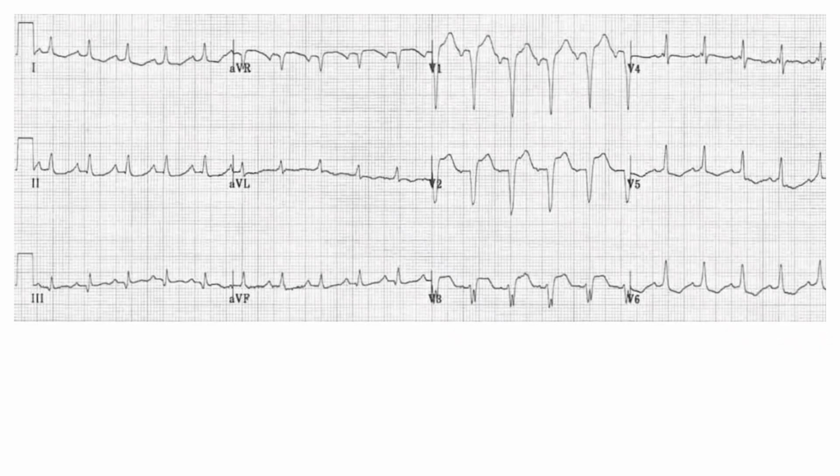Let me see this ECG. Here also you can appreciate that there is a dominant S in V1. There is a dominant R in the lateral leads: 1, aVL, V5 and V6. So this is something fitting into the left bundle branch block pattern. But one very important point is that here the QRS is not wide.